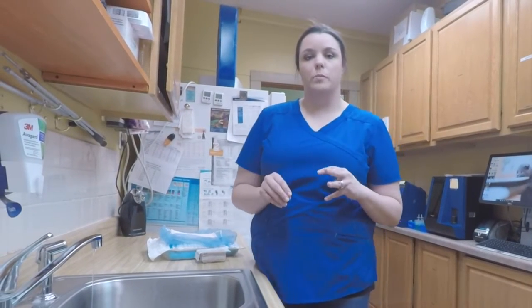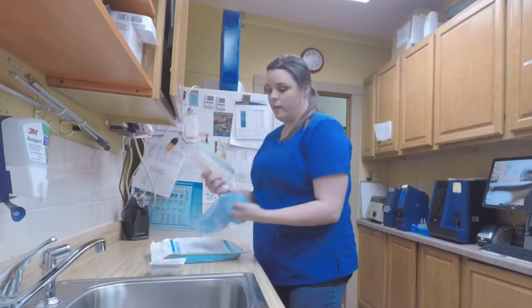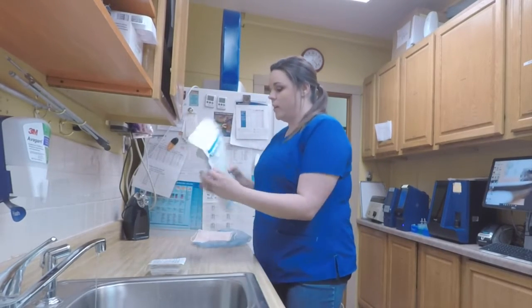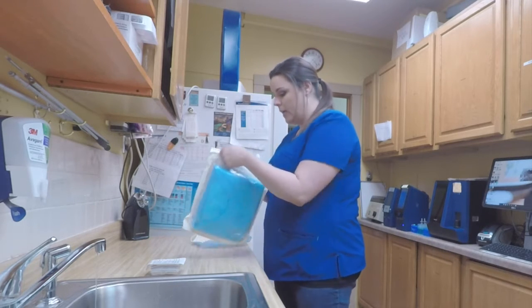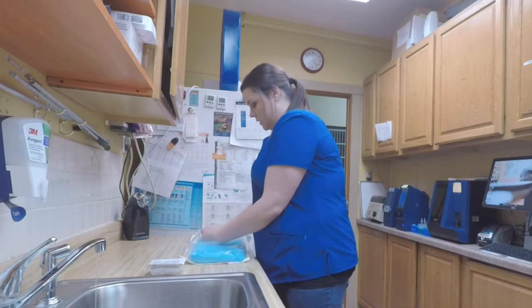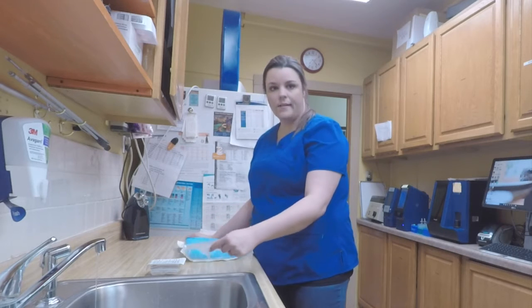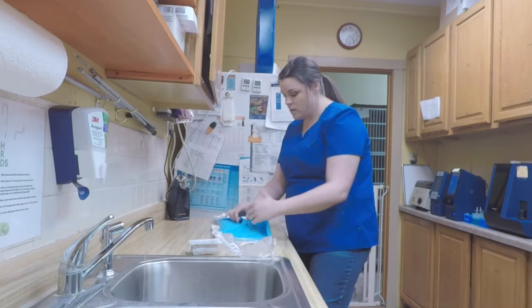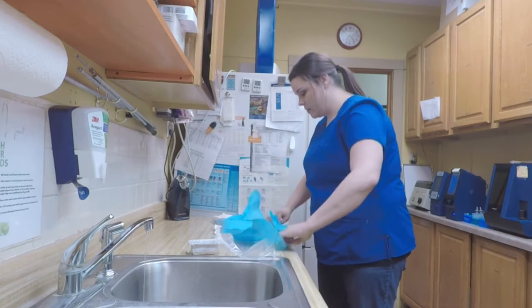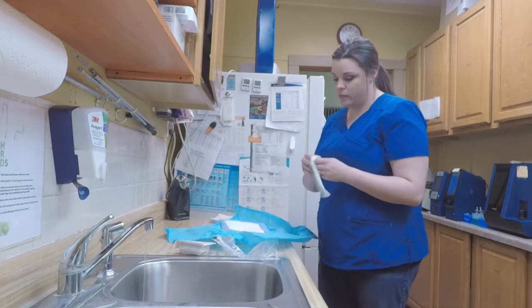Okay, this is how to properly scrub in for a surgical procedure. You're going to need your hand scrub, your face mask, your hairnet, and then your gown and your drape will be in there. So you're going to want to start by opening up your gown like so. And then you're going to want to dump your gloves onto it.